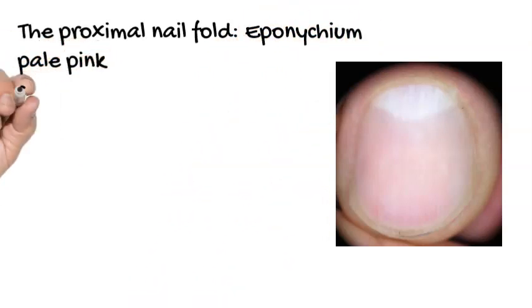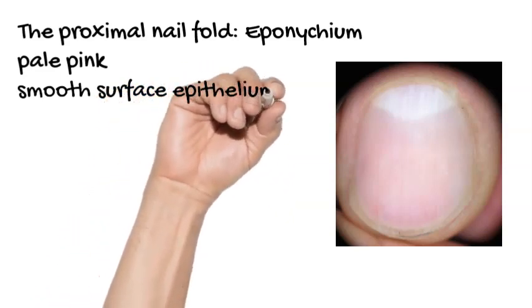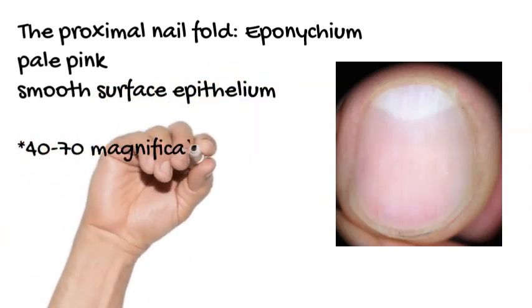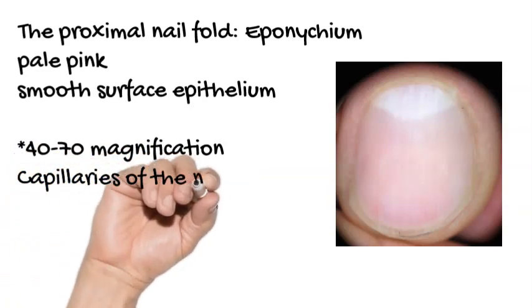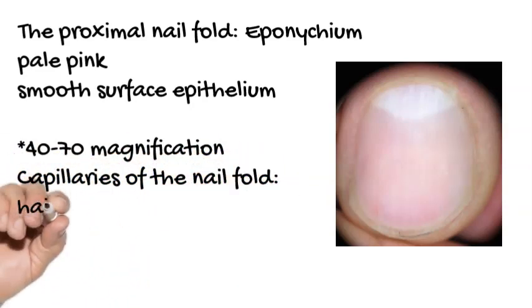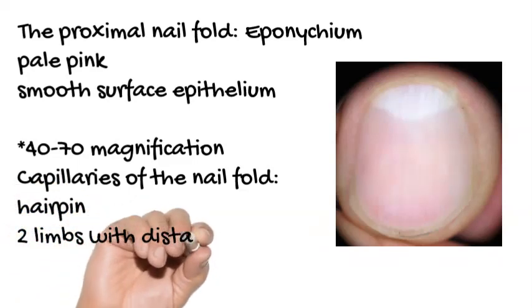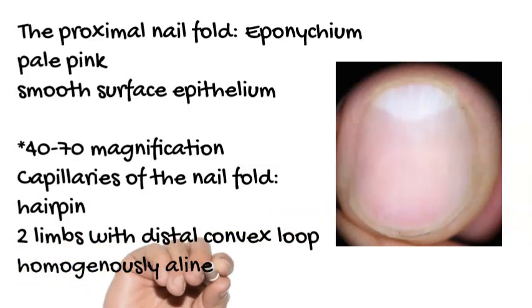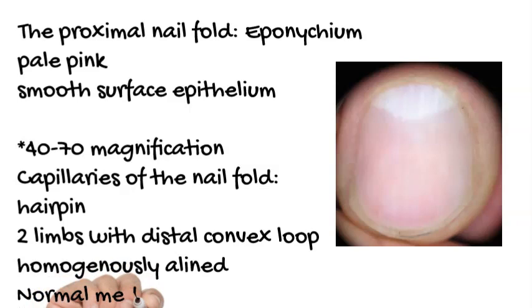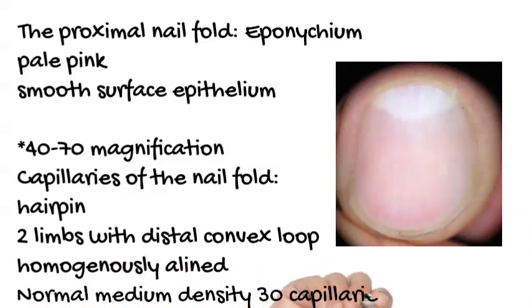The proximal nail fold will appear as a pale pink smooth surface epithelium. At 40 to 70x magnification, the capillaries of the nail fold appear as a hairpin-like structure with two limbs and a distal convex loop, homogeneously aligned, with normal medium density of about 30 capillaries per 5 millimeters.